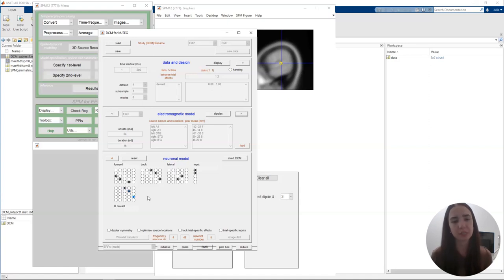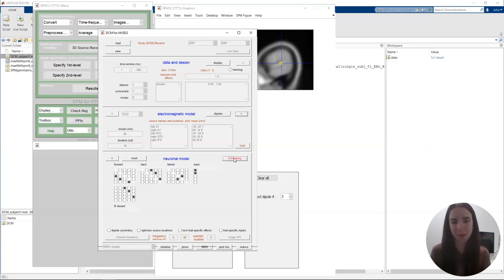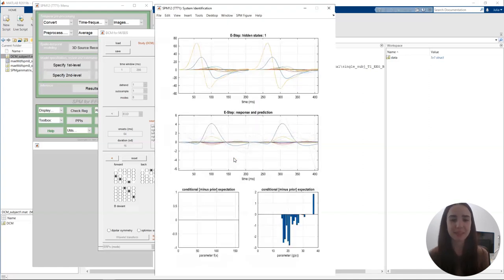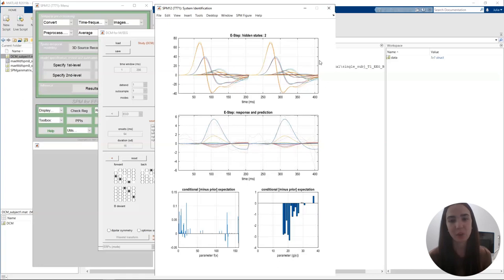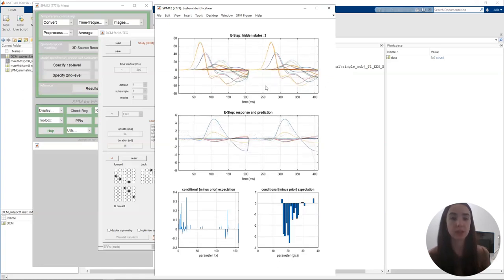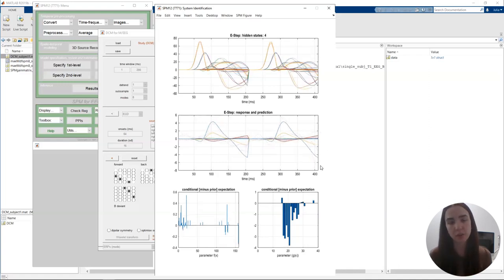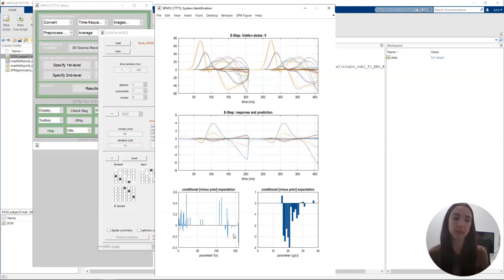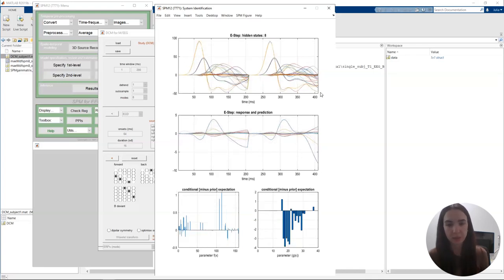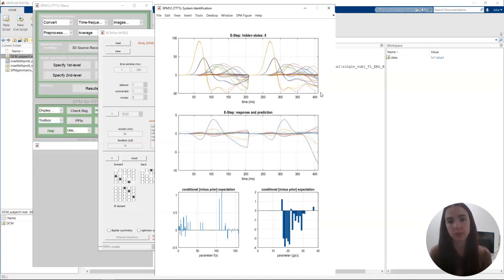In this example, imagine we only want backward connections in our B matrix — that's our hypothesis. We make that change and then click Invert DCM and the magic happens. You'll see a window pop up showing the hidden states at the top, which will change as you go through various iterations. Then we have our response and prediction — this is our data that we're trying to fit, with the predicted response overlaid on top.